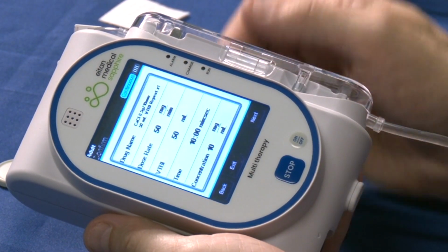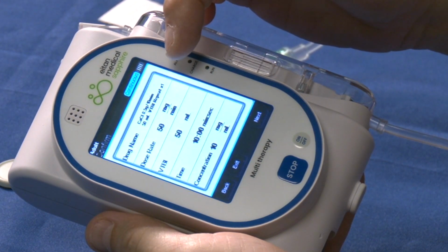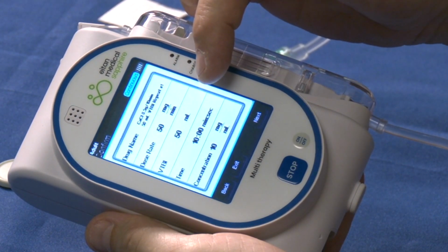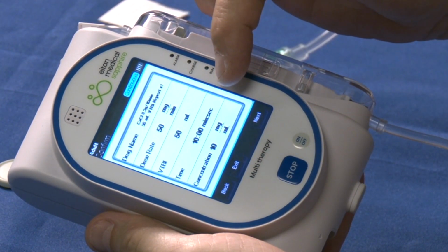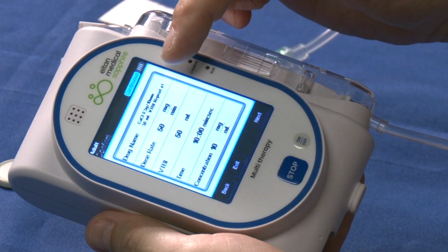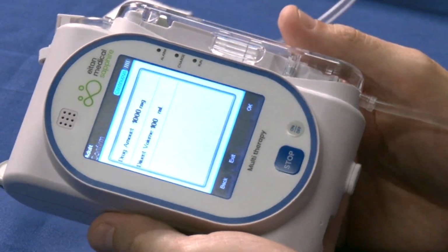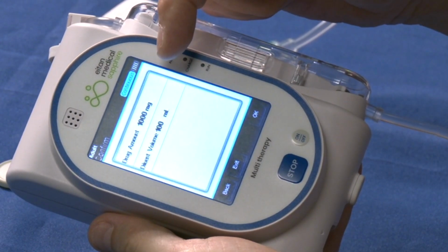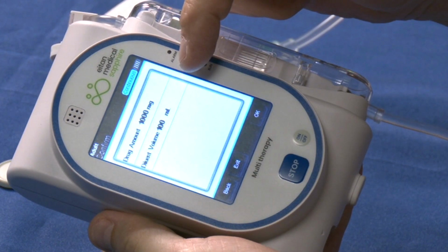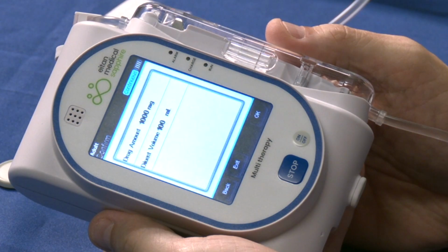On this screen, we can verify all of the information entered is correct. Our medication we are administering, the rate of infusion, volume to be infused, the time in which it takes to infuse the medication, and the concentration of our medication. If all of this information is correct, tap Next. We now confirm that we have prepared 1,000 milligrams of medication in 100 milliliters of volume. Tap OK. Tap Start to start the infusion.